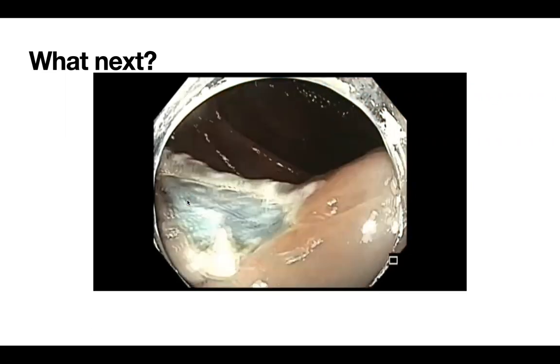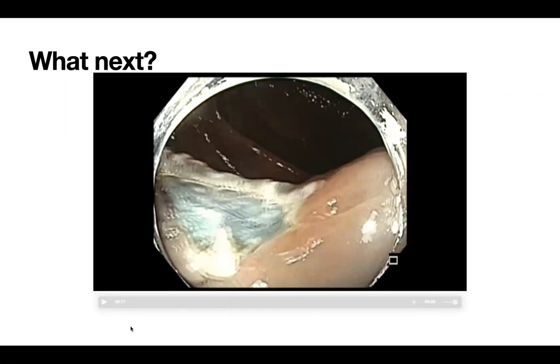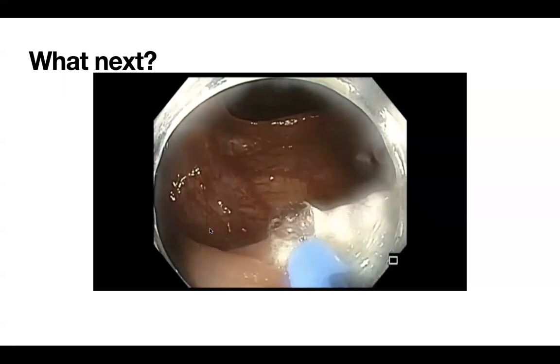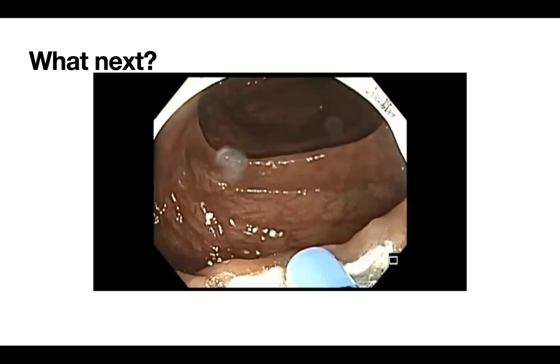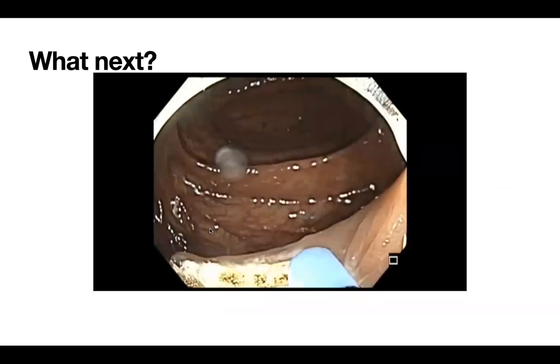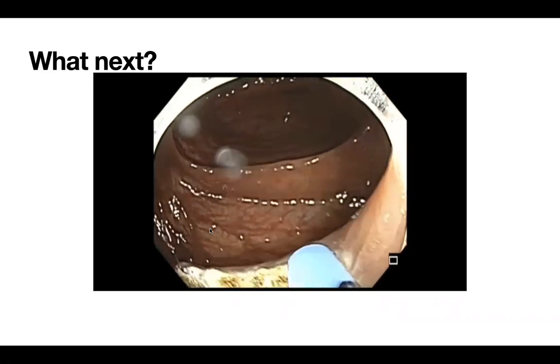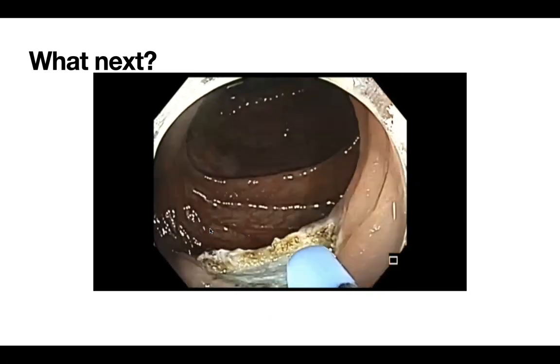Actually, anyone who's interested should read a beautiful paper by Michael Burke published in Gut, where they comment about depth of resection. If you see nice blue connective tissue, then you know that it's submucosa. Muscle is white. If you see white bands or damage to the muscle, you should certainly close defects that have damage to the muscle, either superficial or deep.